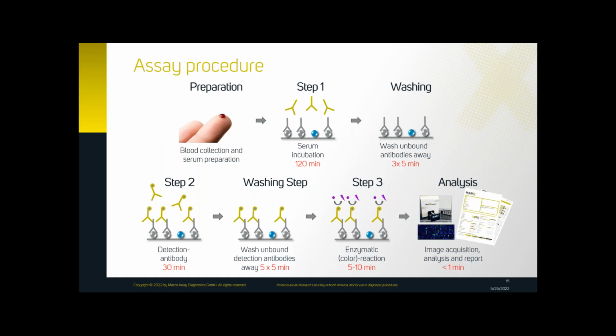The manual assay procedure or lab procedure is followed by the image acquisition using the ImageXplorer device, and also a small ImageXplorer device is built in the MAX 45K or MAX 9K. The quantification is a colorimetric readout, and the test results are analyzed with the RAPTOR server software and reported in Ig response units.